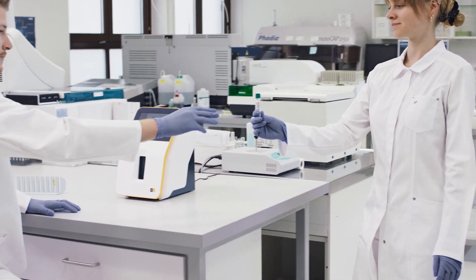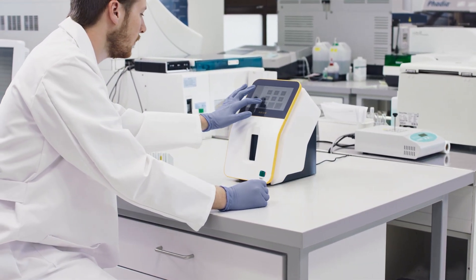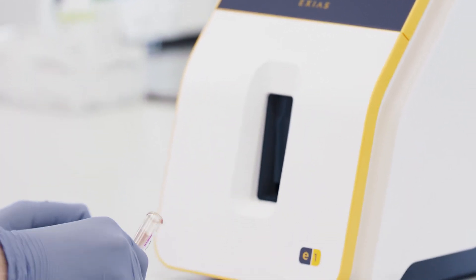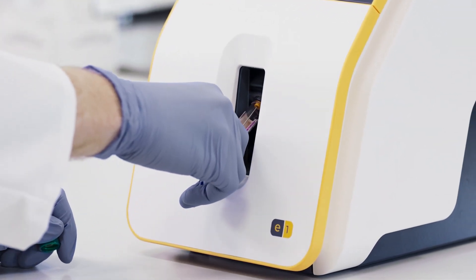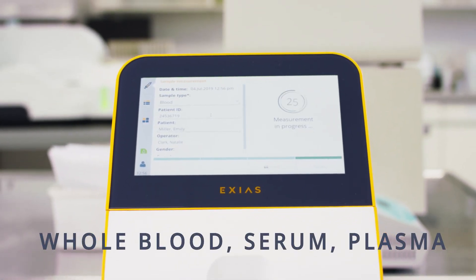The Exius E1 Analyzer makes it possible. An electrolyte system that is intended for in vitro measurements of sodium, potassium, chloride, calcium, as well as pH and hematocrit, measured in blood, serum, and plasma.